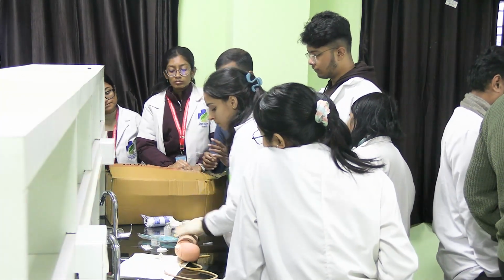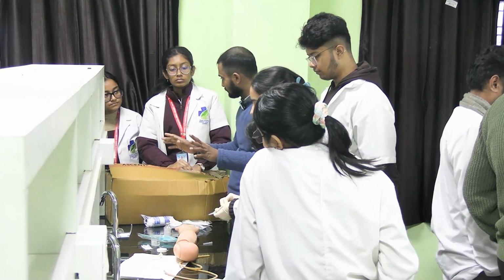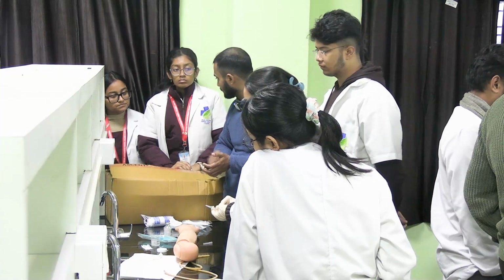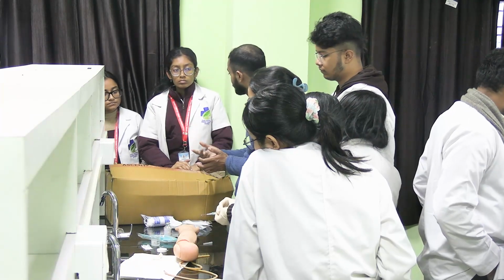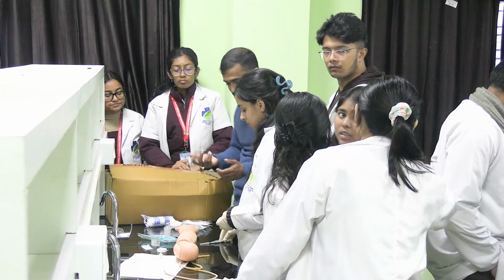This needle sometimes might be confusing. If there is waste management near you, you can break the needle in the needle breaker and discard it directly there. If not, at that time you just cover it with the needle cap, to avoid needle stick injury.